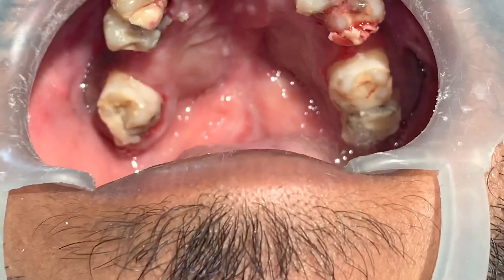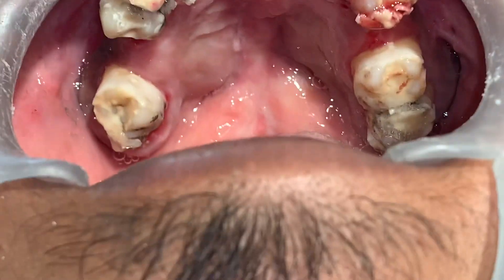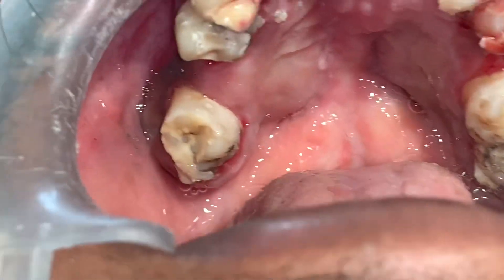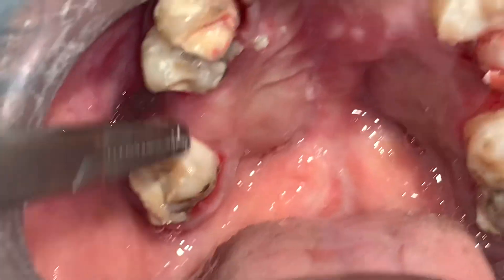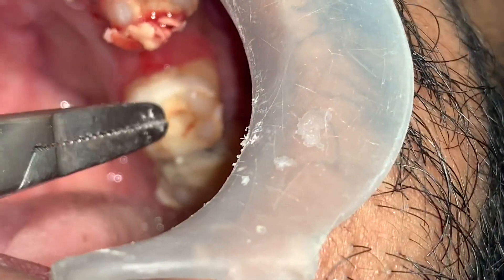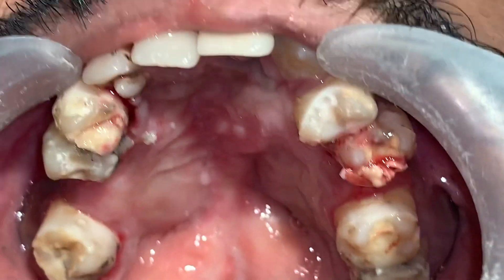Now if you see carefully here, between the premolar and the molar, that's where we've got new bone. It's from this point to this point — that's about 12 millimeters, and again about 12 to 13 millimeters here. That's the new bone we've achieved.